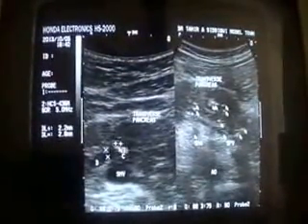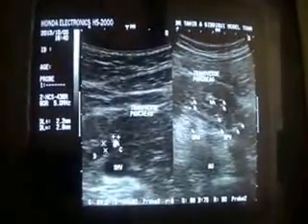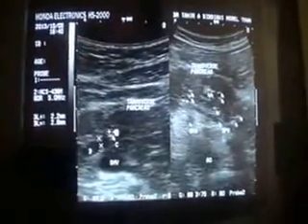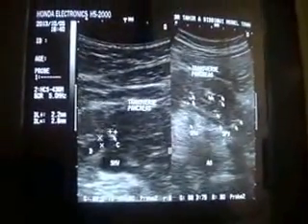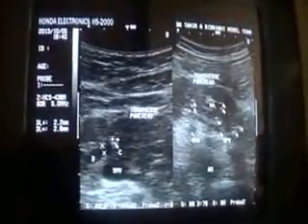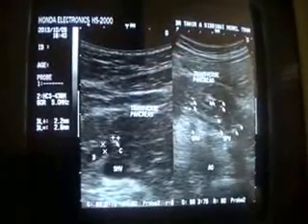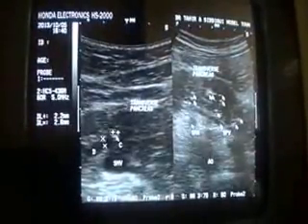This is a tiny calculus, maybe about 2.2 millimeters, within the duct of the pancreas which is at the upper limit of normal. So this is a case of chronic pancreatitis with multiple pancreatic calculi in the pancreatic substance as well as in the pancreatic duct. Thank you very much.